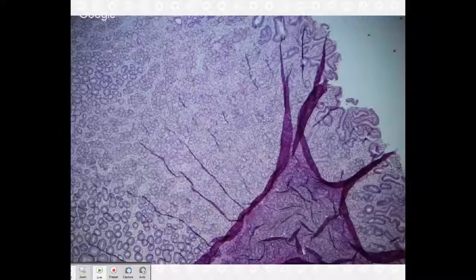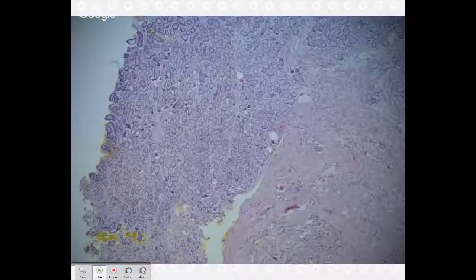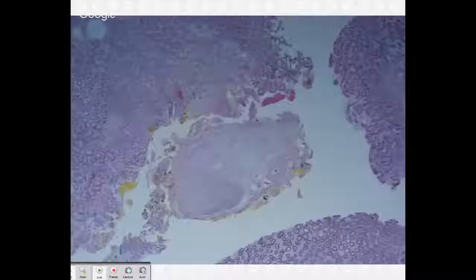All right. So number 2, this is a 55-year-old man with abdominal pain. Let me just make sure I'm in focus. Can we even go farther out? Oh, we can. Excellent. I like the 2x for this one.